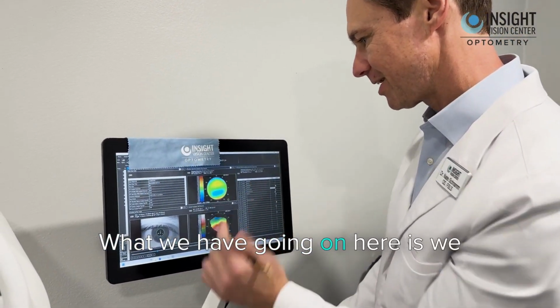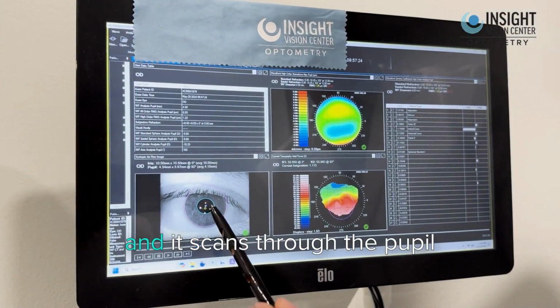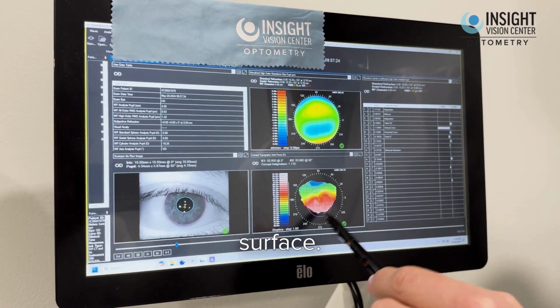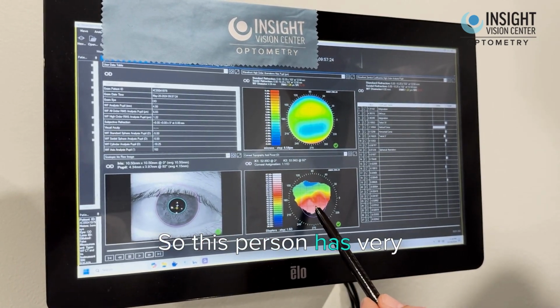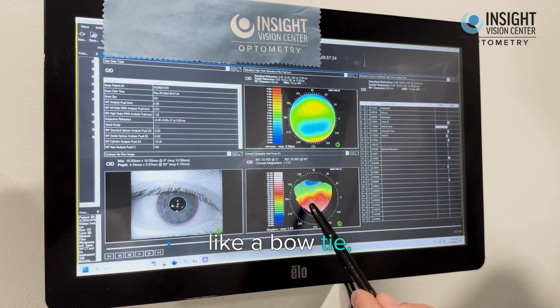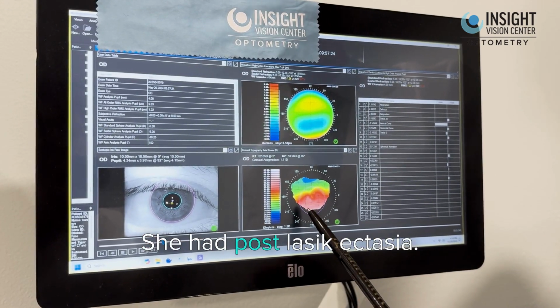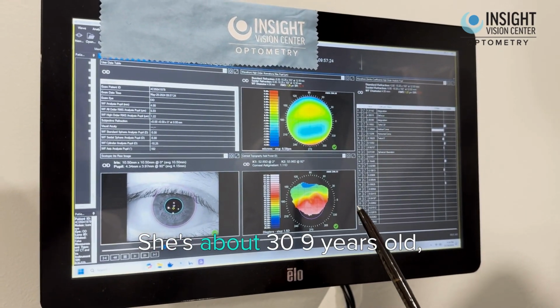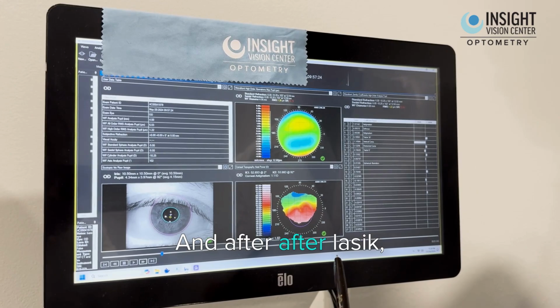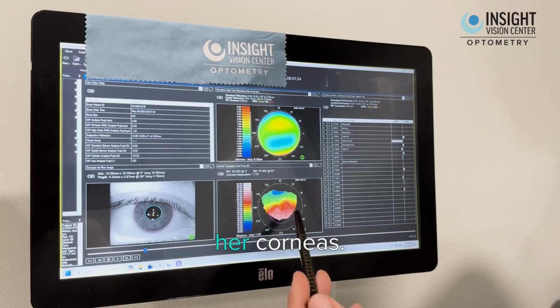What we have going on here is we did a scan of this patient's eye, and it scans through the pupil and measures the corneal surface. So this person has very irregular astigmatism. Astigmatism should be shaped like a bow tie, but we have a really steep cone right here. She had post-LASIK ectasia. She's about 39 years old, Asian lady. And after LASIK, she was rubbing her eyes a little bit too much and she ended up damaging her corneas.